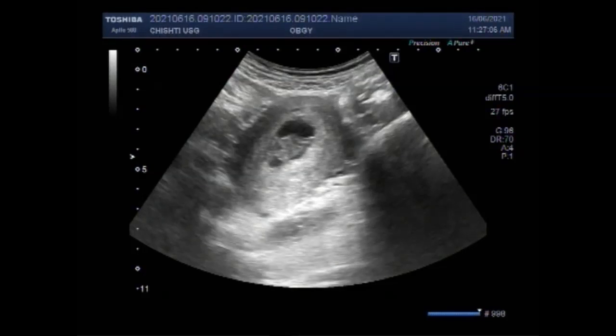Dear viewers, I hope you are all fine. This ultrasound video shows a case of missed abortion, also called missed miscarriage, with pregnancy of about 8 to 9 weeks.